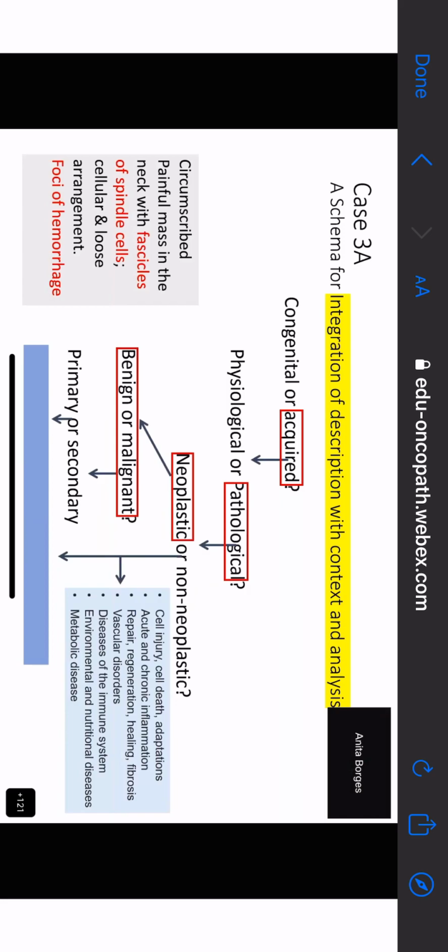It is not a lymph node. There was no lymphoid tissue over here. It was circumscribed, yes. But many things are circumscribed and they're not lymph nodes. So what actually is the diagnosis? It is a schwannoma with degenerative changes. Now this is not something that you should not be able to recognize, provided you make the right observations, the right interpretation, and then you can make the right diagnosis. Do you agree with me?